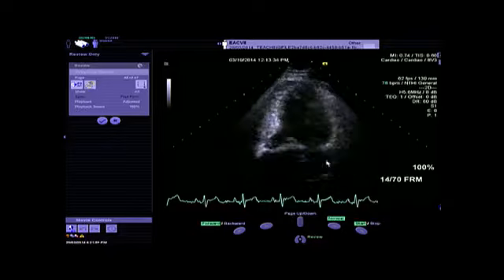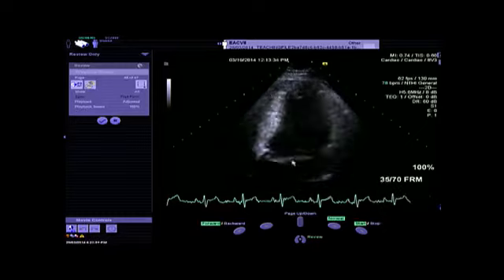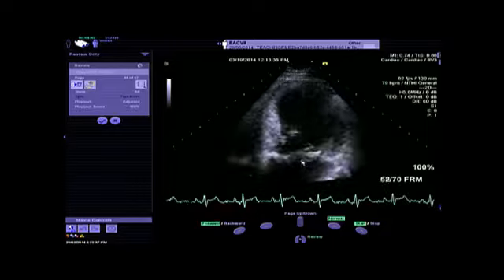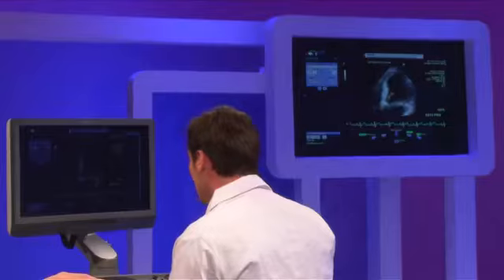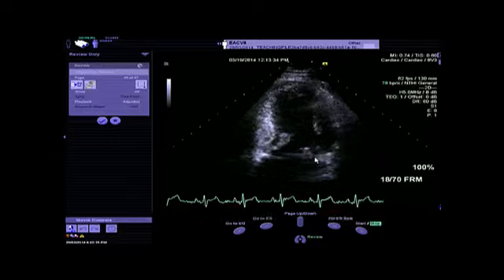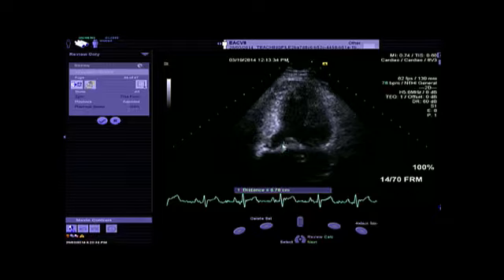And with this apical four-chamber view, again, you need to assess the excessive motion of the mitral leaflet, touching here both leaflets. And you see also an extensive calcification of the mitral annulus at the level of the posterior mitral annulus that will also affect the likelihood of mitral valve repair. And you need to also evaluate the redundancy of the mitral leaflet, and the redundancy is defined when the mitral leaflet in diastole is greater than 5 mm, as you can see in these patients with a thickened mitral valve leaflet.